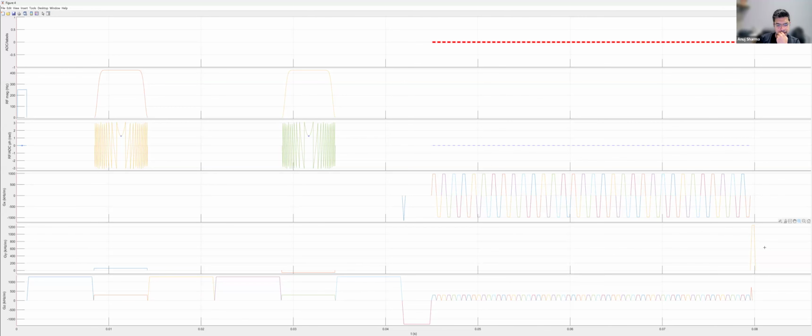Okay. So you can have the kind of square gradient, and then you can put the square gradient into each of the blocks. And that will basically create a continuous gradient, which will not stop anywhere. And then in the end, after you're done with the trajectory, you ramp it down to 0 again, or continue maybe to the spoiler if you need a spoiler. Does it make sense? So basically, yeah, you can create these gradient segments with infinite slew, basically flat, and then just add them to each of these bipolar readouts to play them simultaneously.